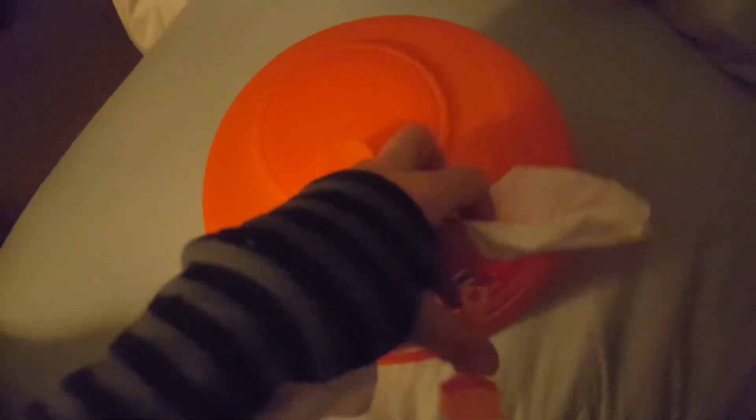You put him in and have the other person hold the top down because he totally busted out. After you shake it well — if you have this you know how to use the puffer — I made sure I wrapped the tissue and stuffed and sealed all the holes. Then as he was in there I would do a puff, count to ten, do another puff, count to ten. Do as many puffs as you need, up to five — I wouldn't do more.